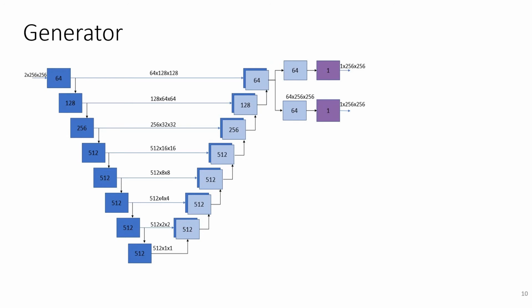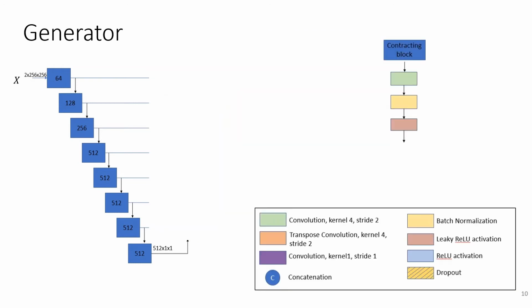The generator network used in this study is an encoder-decoder network with a U-Net-like architecture, having skip connections between the layers. But unlike the U-Net, this decoder branches into two different outputs representing our two tasks. The encoder, as shown, takes in an image X of the size 2 x 256 x 256, with 2 being the number of channels.